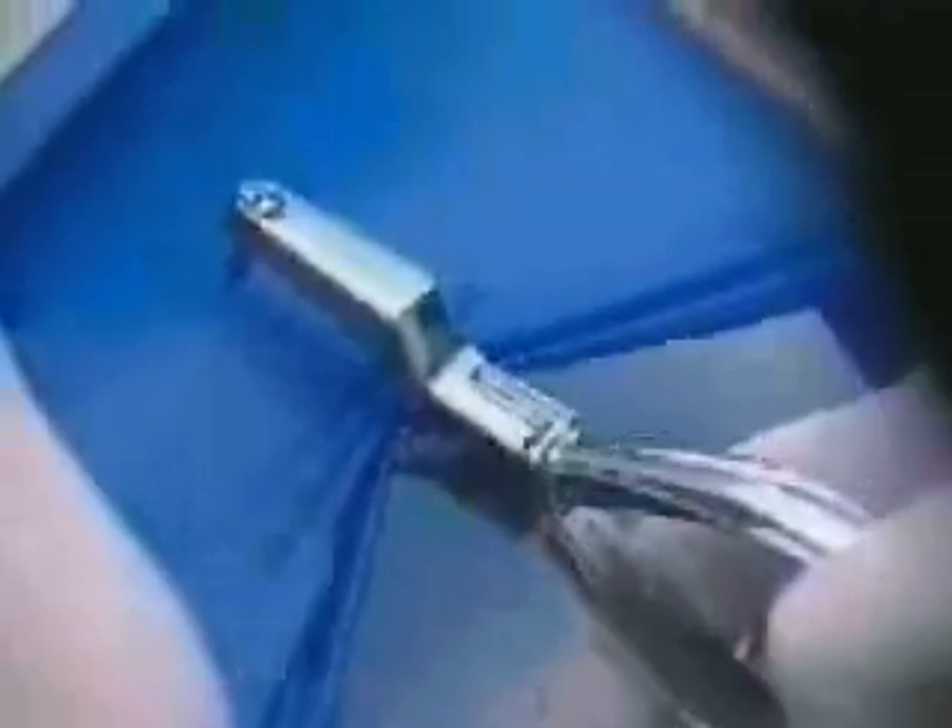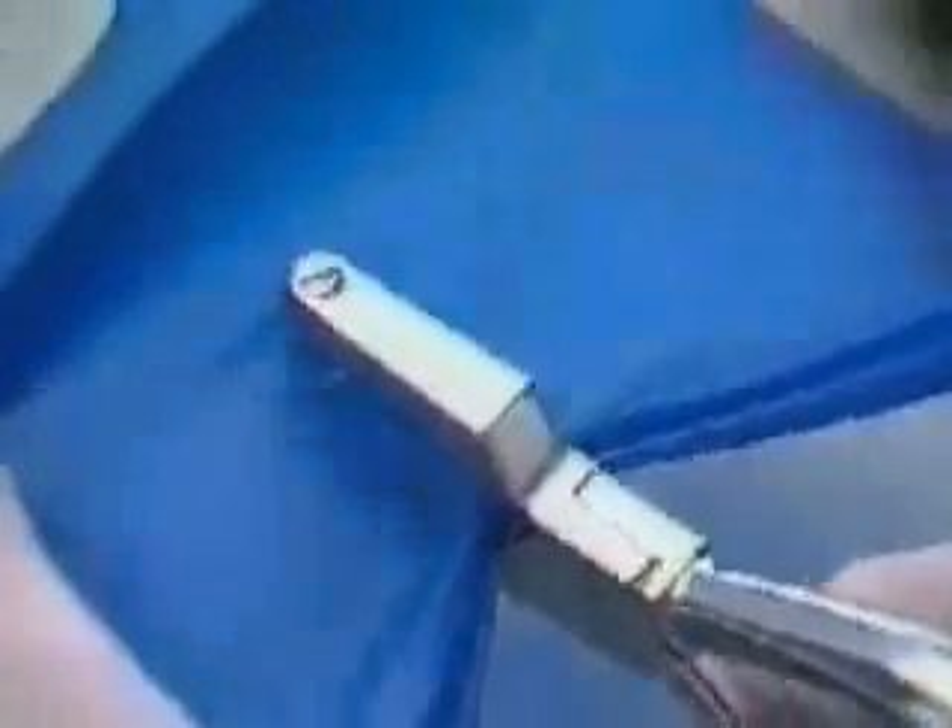Prior to punching the holes, remember to check for bridges, missing teeth, and mal-aligned teeth in the quadrant to be isolated. Depending on the teeth to be isolated, you must then choose which size hole or holes to punch in the rubber dam using the rubber dam punch.